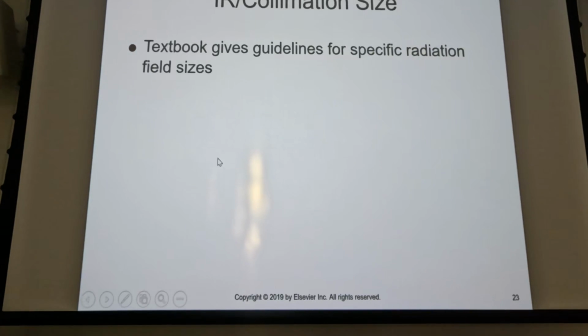All right, so collimation. Again, what are your 2 rules for collimation? Collimate to the part and never larger than the image receptor, right?